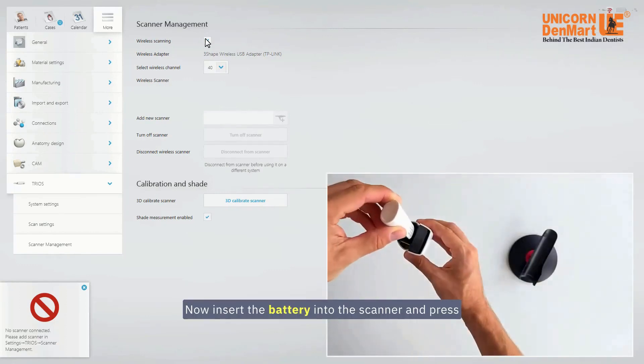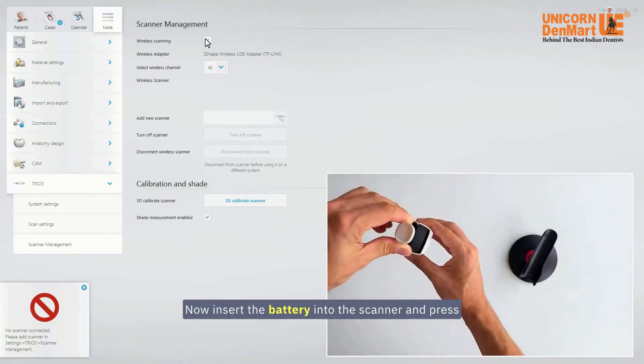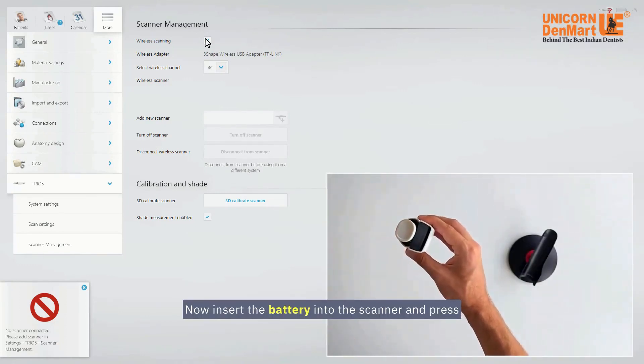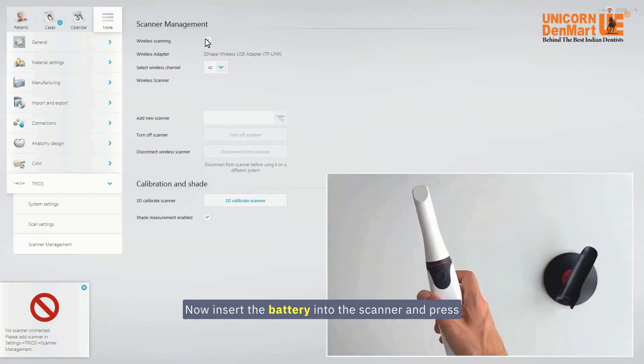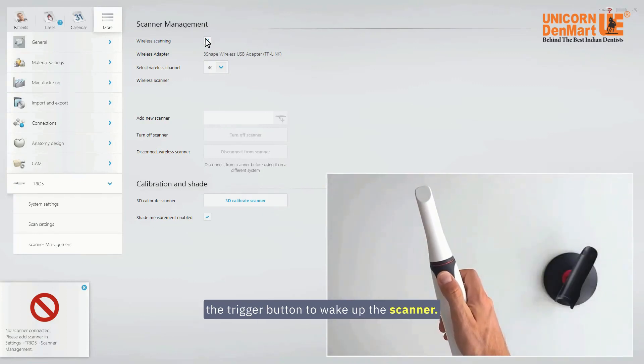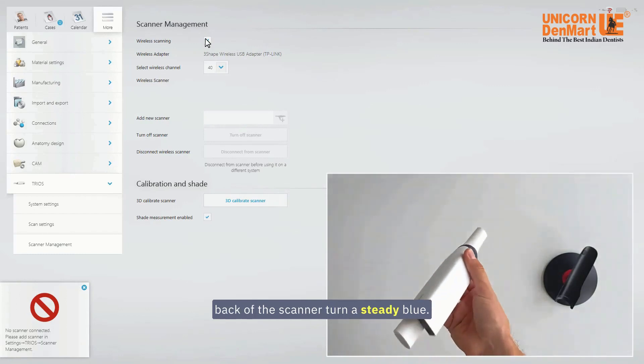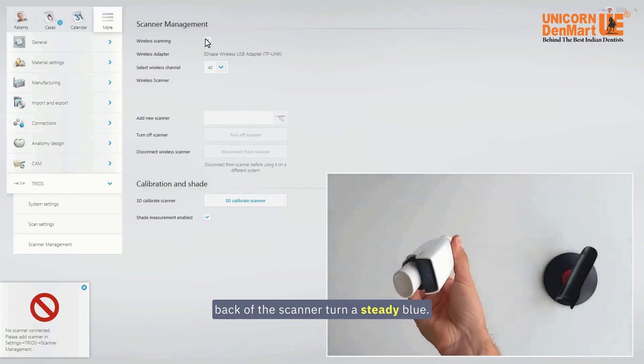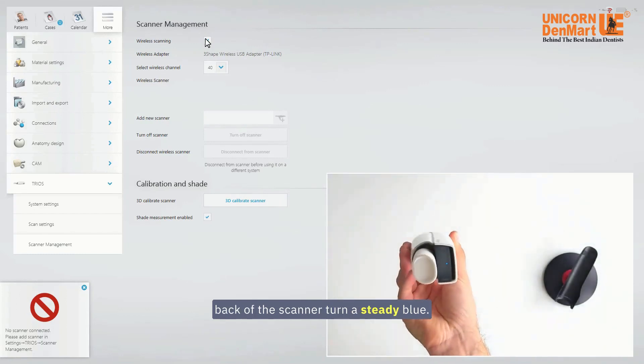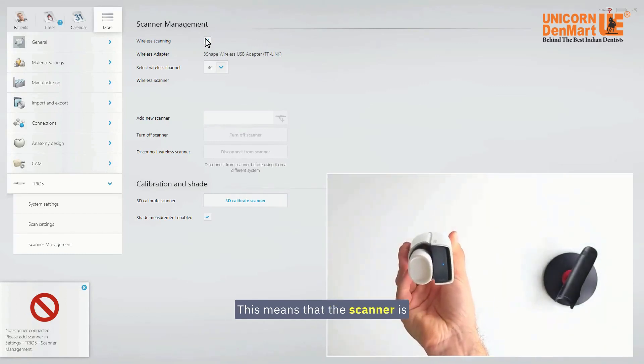Now, insert the battery into the scanner and press the trigger button to wake up the scanner. This will make the status light at the back of the scanner turn a steady blue. This means that the scanner is on and available for pairing.